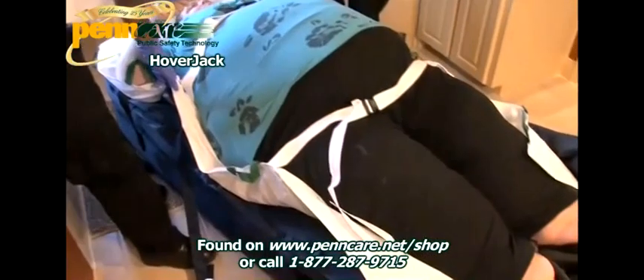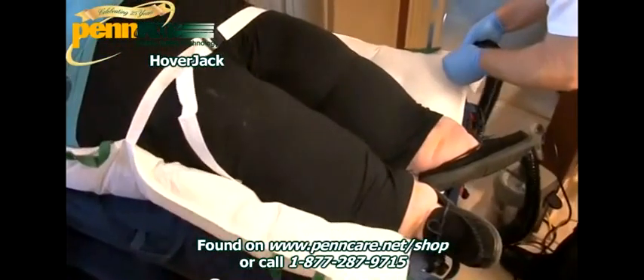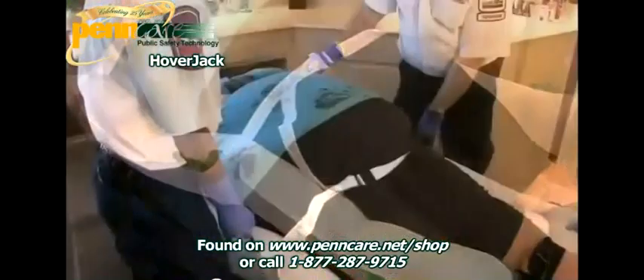The Hoverjack inflates to lift patients from the floor to bed or stretcher height in a supine position, maximizing patient comfort and minimizing the risk of injury to both patient and caregivers.